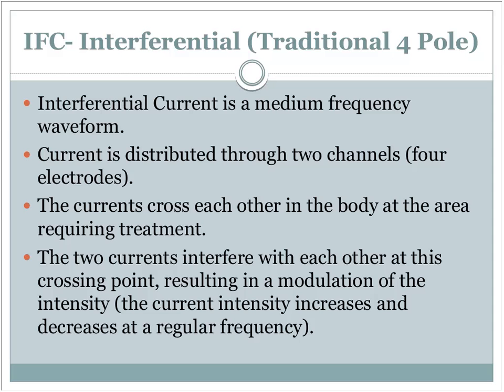And I've always kind of described it as, one side is going at 3,000 hertz, the other channel is going at 3,001 hertz. Now, if you can remember back to some basic physics that you may have taken in high school or college, when two waves meet, if the two waves meet at the same time at a peak, to the top of the waves, it will double the amplitude. If two waves meet, one at a peak and one at a trough, so in other words, one's up and one's down, they cancel each other out.